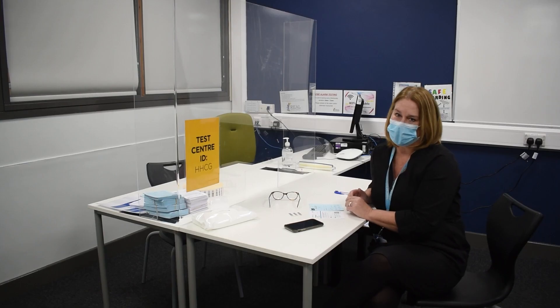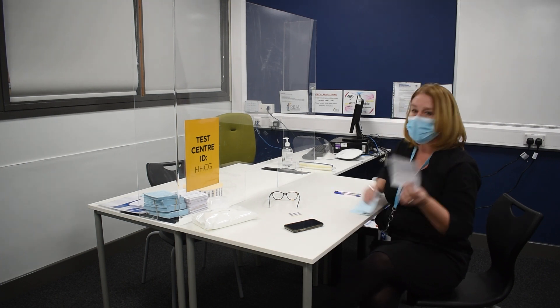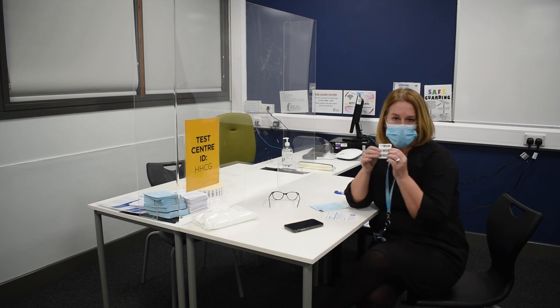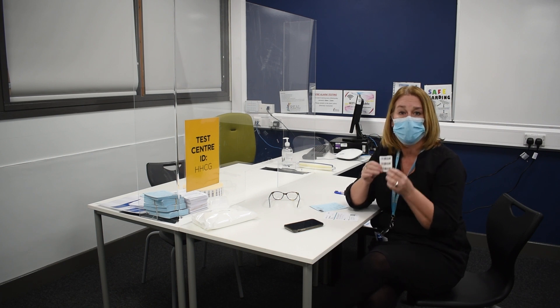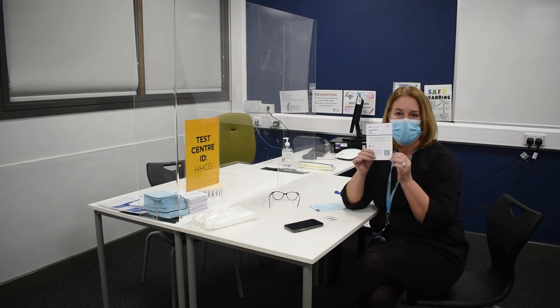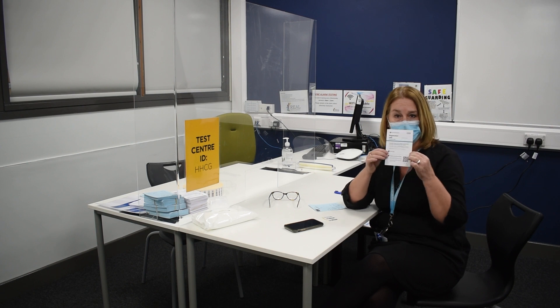So the first stage is registration. For students your registration will be done in your tutor group, but when you come down here if you haven't been able to register you will be given two cards and three barcodes. You'll get strict instructions as to how to use these and you'll also be asked if you have any Covid symptoms, because this testing is only for people who have no symptoms of Covid. You will be asked to scan this QR code which will take you to the registration part of the NHS's online form.